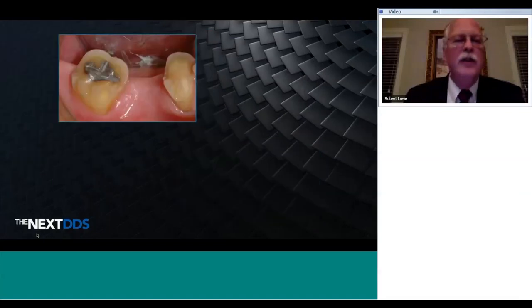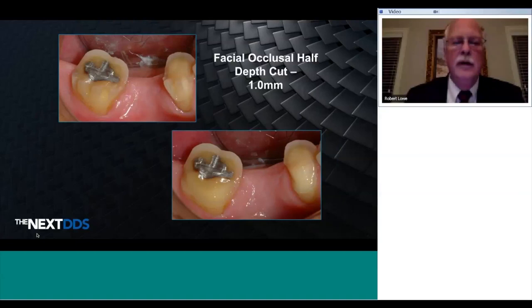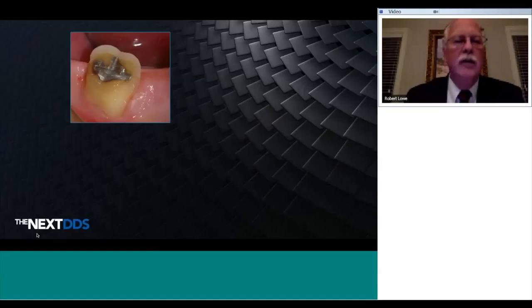Next we go to the facial surface. Occlusal half, depth cuts. You see a temporary shoulder there. Now we do the cervical reduction. So we have two planes of reduction. Remember, the prepared cusp tips should be in line with the unprepared cusp tips.